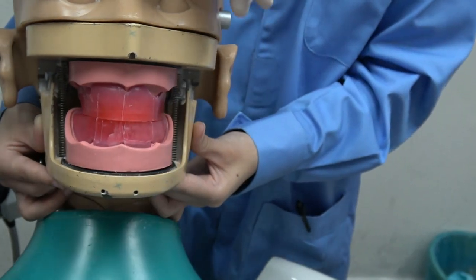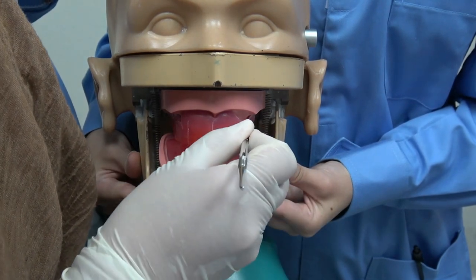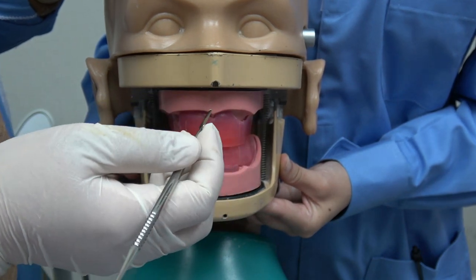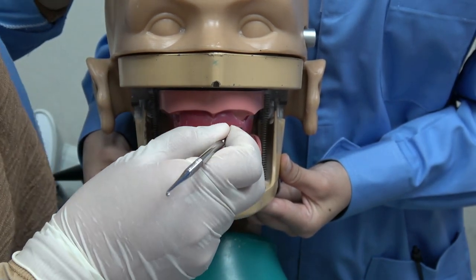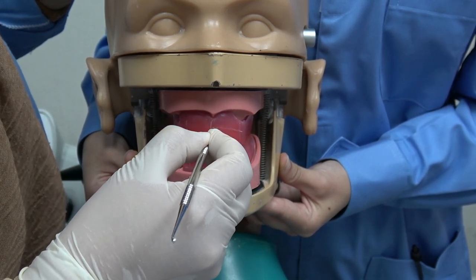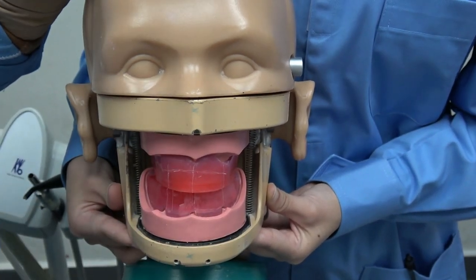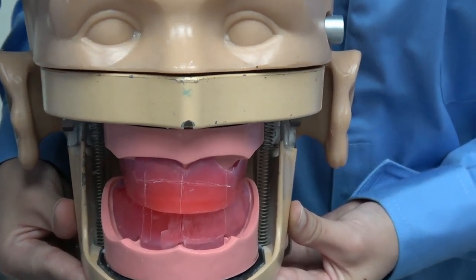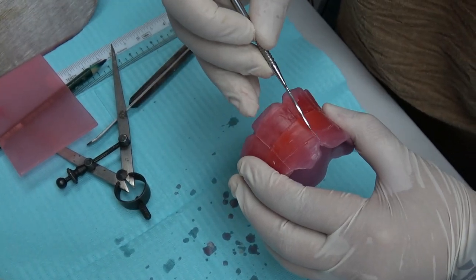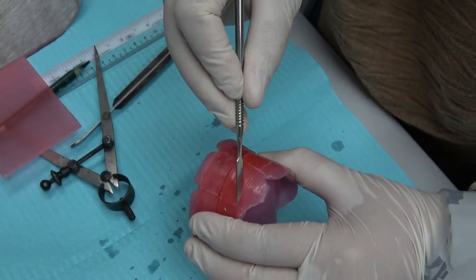And the last one is the smile line. Just assume. In the real patient, it should be on the inferior border of the upper lip. You ask your patient to smile and then you make the line. But here we just assume it here. So if you can see, here is the midline. This is the canine line. And this is the smile line.